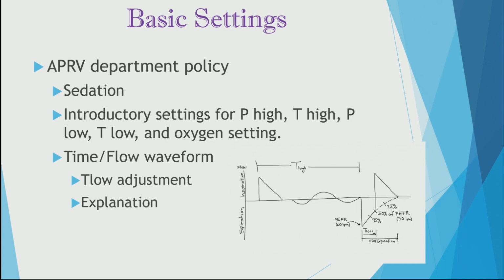Now, before we move on to another slide, I want you to look at the small illustration on the right side of this slide here. This is the flow waveform.